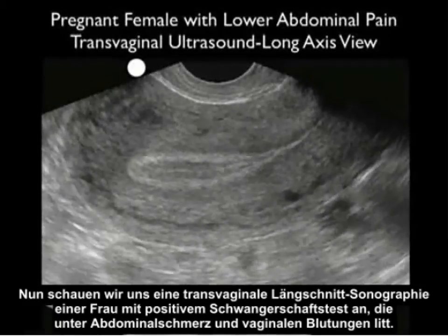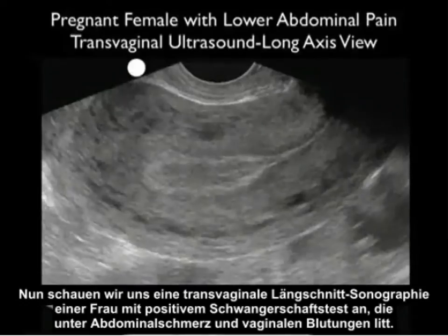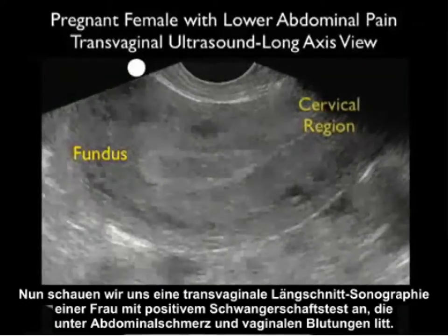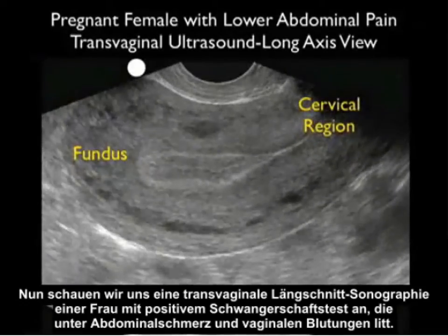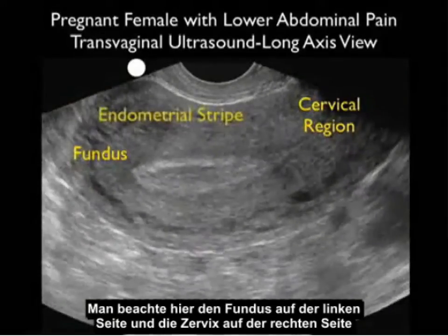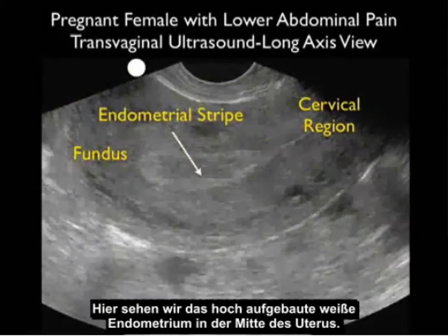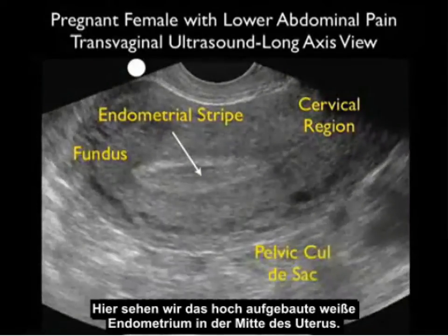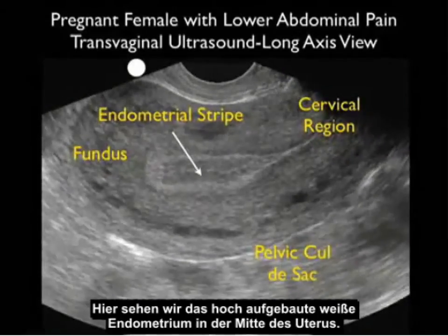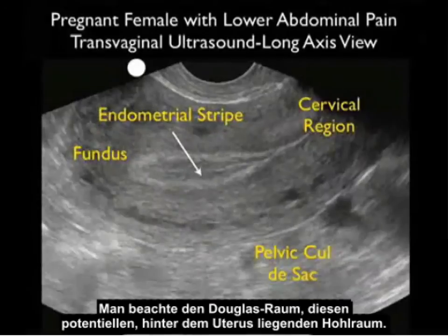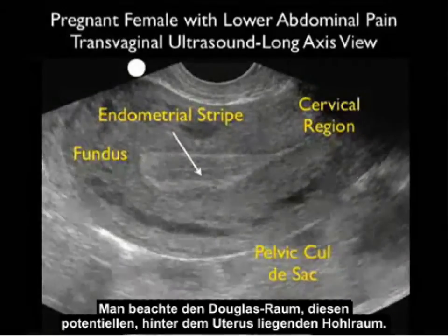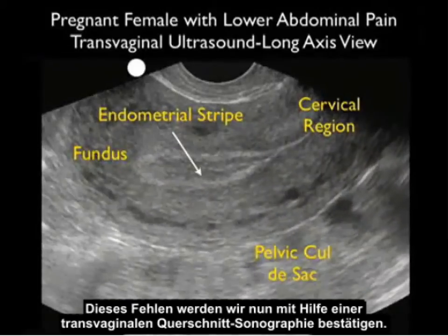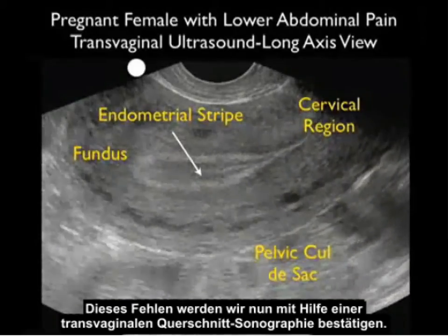Now let's review a transvaginal long axis scan from a woman who presented with a positive pregnancy test, lower abdominal pain, and vaginal bleeding. Notice the fundus shown to the left and the cervix to the right. We see a thickened white endometrial stripe in the midline of the uterus, the pelvic cul-de-sac — that potential space posterior to the uterus — and notice the absence of an intrauterine pregnancy.